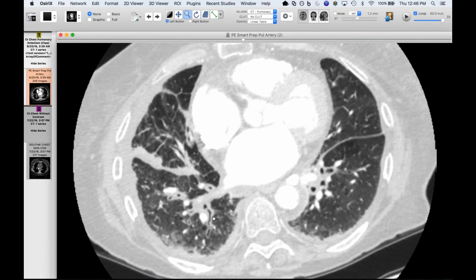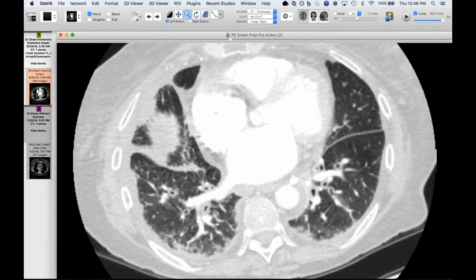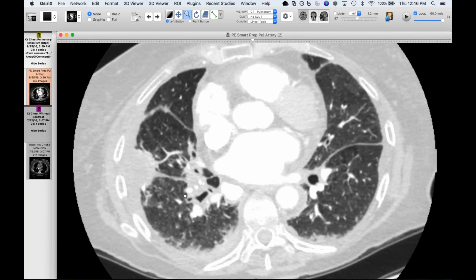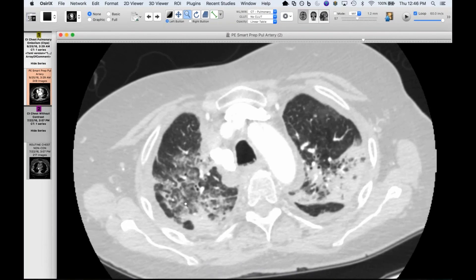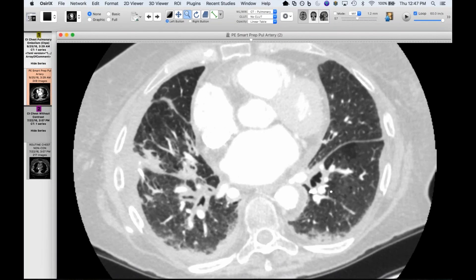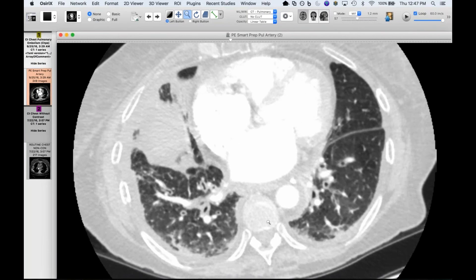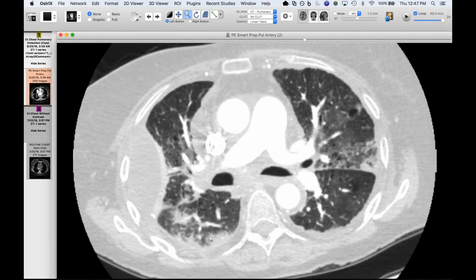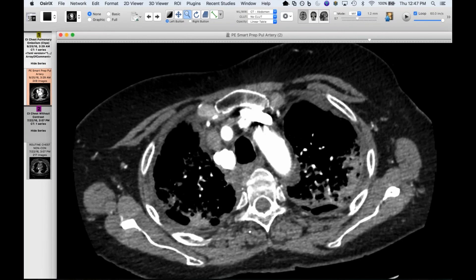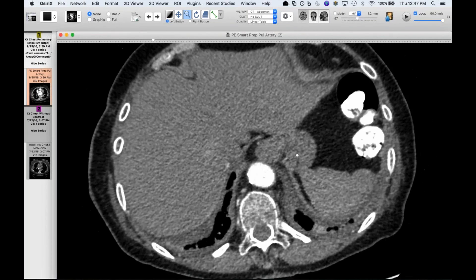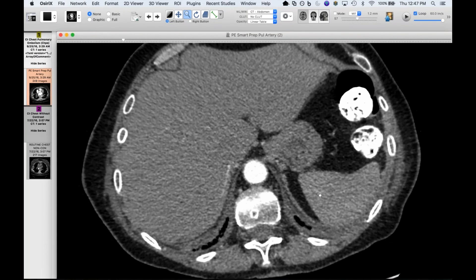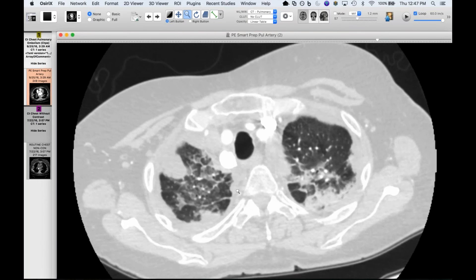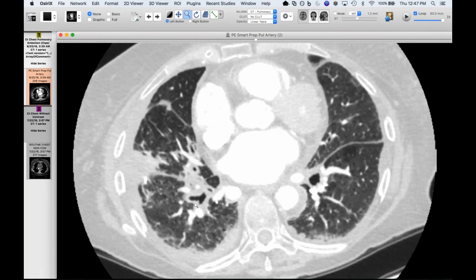For lack of a better question — what is it? They said she was diuresed, but I wasn't crazy about this being edema just because it's so thick. She doesn't have a known malignancy. I'm worried about some sort of lymphatic process — lymphangitic carcinomatosis — but I don't know about some other lymphatic process, even something like Erdheim-Chester. What we see of her kidneys looks good, but some sort of deposition — be it amyloid, be it cells in the lymphatics. I tend to think this is going to be some sort of lymphatic process, but I don't know. They're going to try a transbronchial biopsy. All this has developed since late July — over the course of two months — and not surprisingly she has progressive hypoxemia.